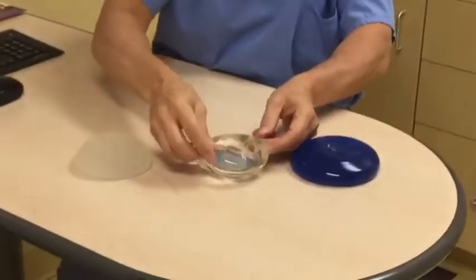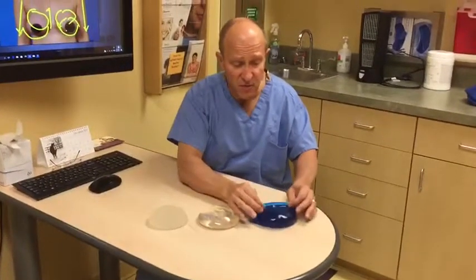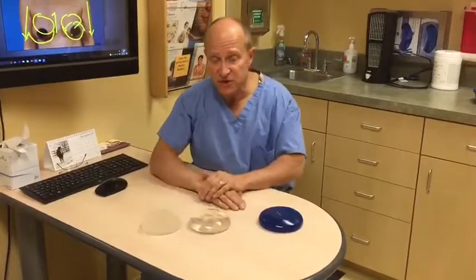So of the three kinds of breast implants, the one that causes bottoming out the most is the saltwater filled device. These are much better options as far as stabilizing the shape of your breast.